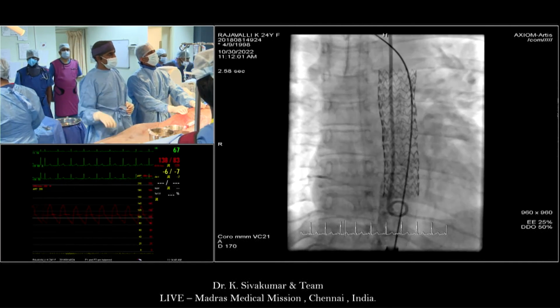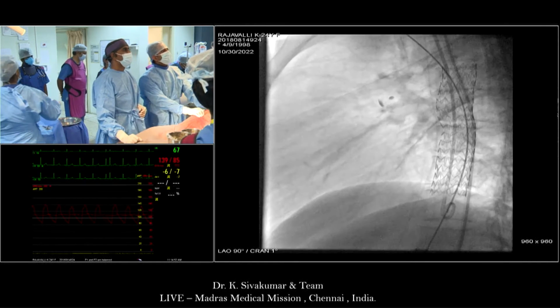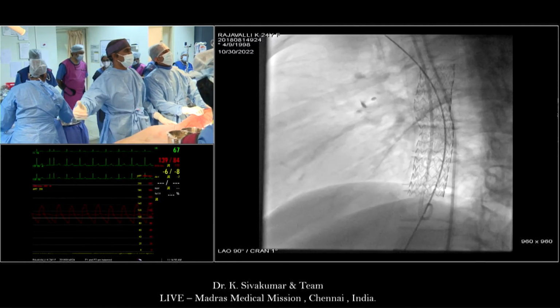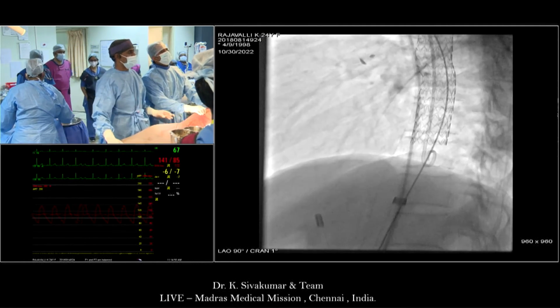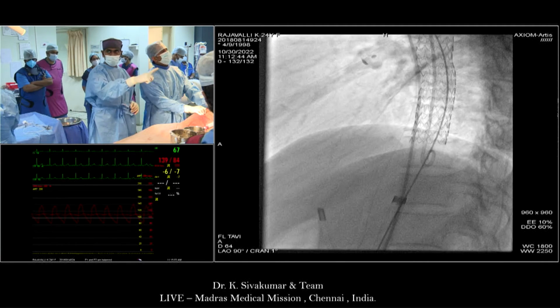By the way, the ACT of the previous patient was 320. That sounds more reasonable, not 999. Shaq, that was at the beginning of the procedure where we didn't have, which it was taken within first 20 minutes. Okay, shall we inject again?